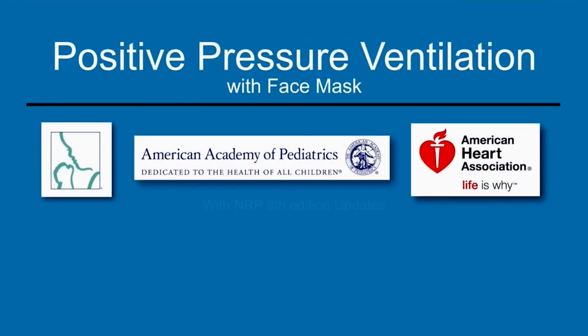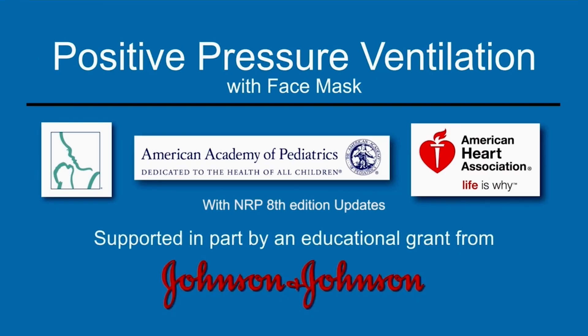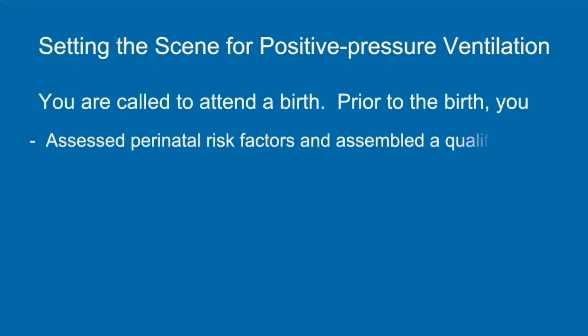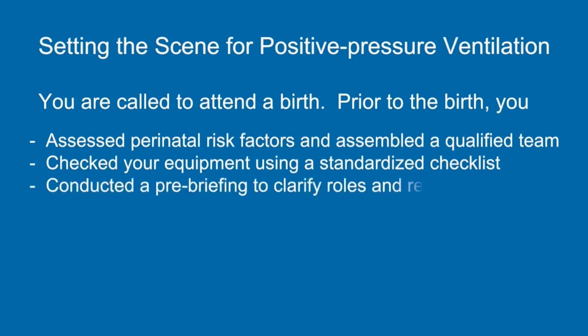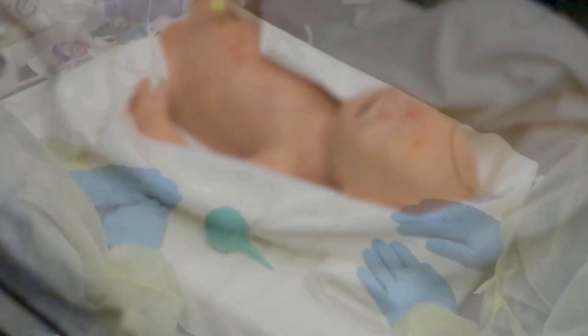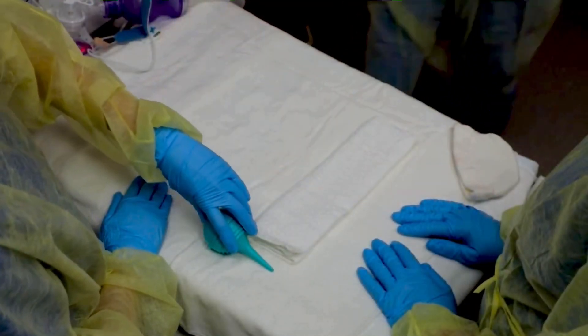This video demonstrates positive pressure ventilation using a PPV device and a face mask. The baby is born and a rapid evaluation is performed. This baby is term but has poor tone and does not breathe or cry at birth. The baby arrives at the warmer limp and apneic.